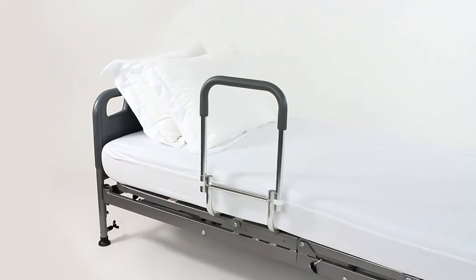Hi, I'm Devin, I'm the head of customer service for Vive Health, and in this video I'll show you how to assemble and install your Vive compact bed rail.